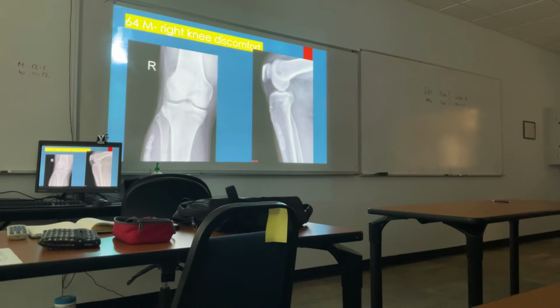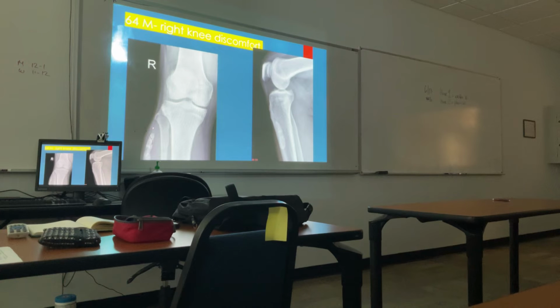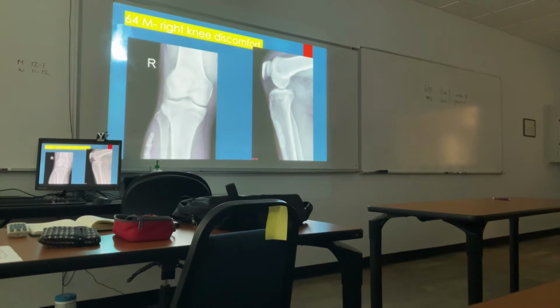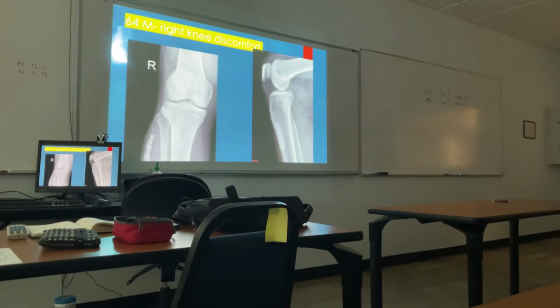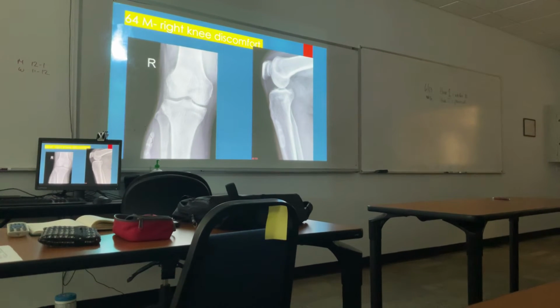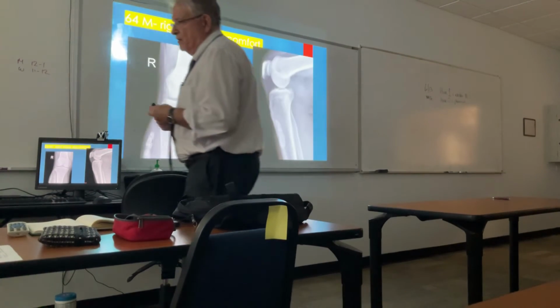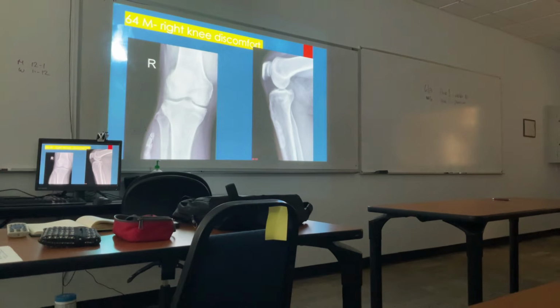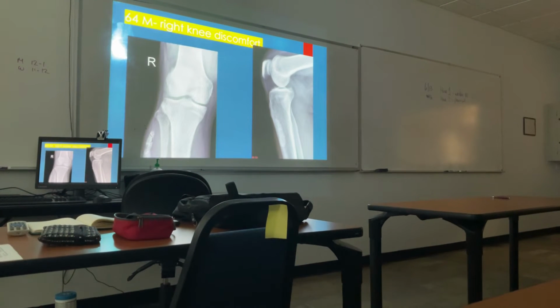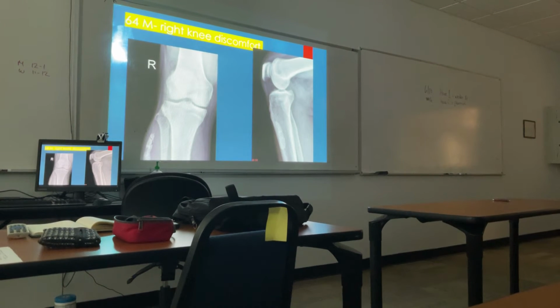Okay, so the first thing is to say this is not a bone tumor. Recognize that, that's why you want the AP view, soft tissue changes. In the old days we called it myositis ossificans, MO. These days we call it HBO, heterotopic bony ossification. Now we haven't done knee positioning, we will. It's an easy examination to do. Obviously we start with hip, then knee, then foot and ankle. All right, so an example of calcification where there shouldn't be calcification.